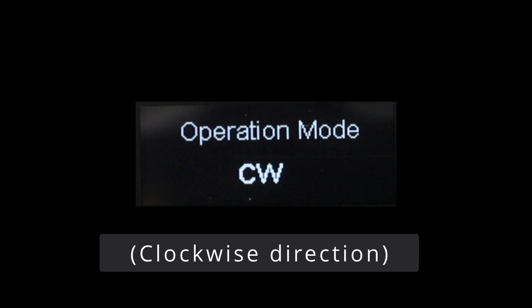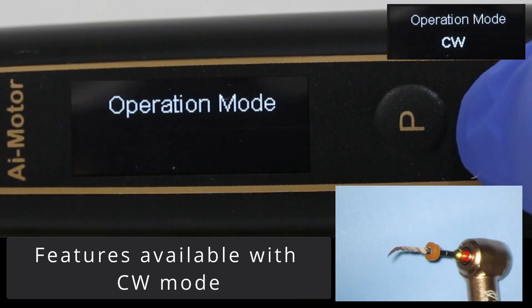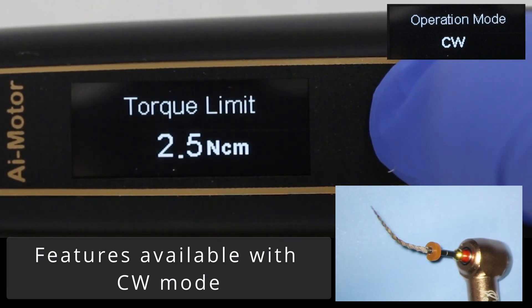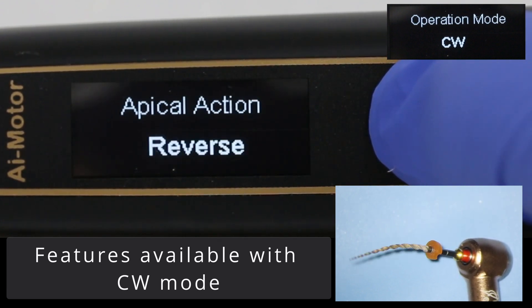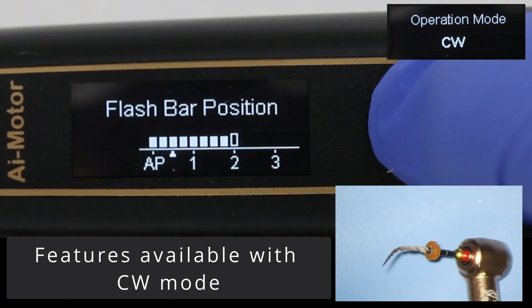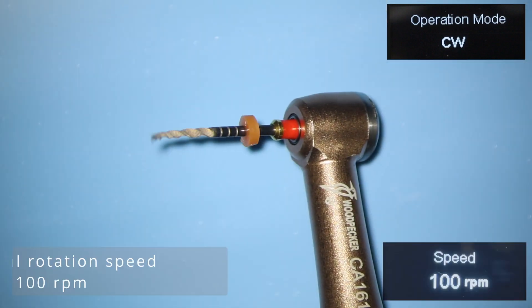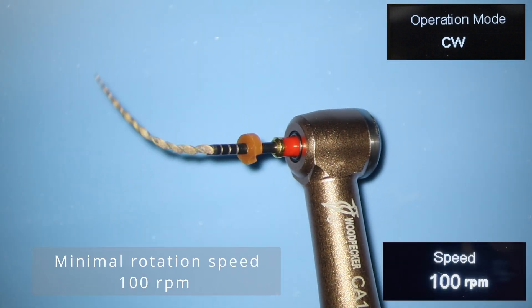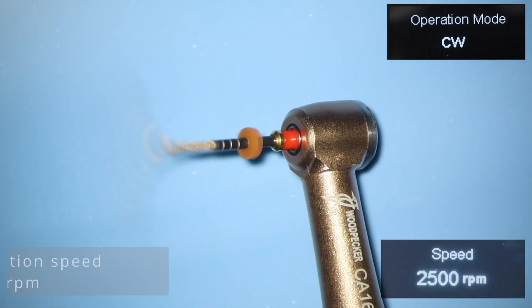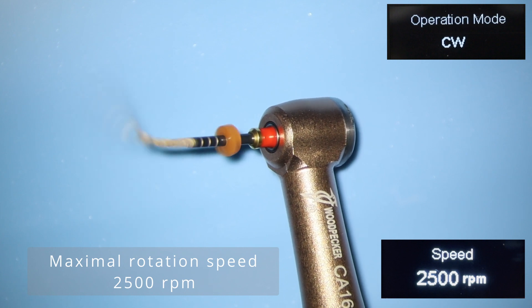The next operational mode is CW, or clockwise rotation. This mode has the most customizable options compared to all the others, and this video will demonstrate the majority of the capability of this handpiece in this mode. You can set the rotation — the minimum is 100 RPM and the maximum is 2500 RPM, which is pretty quick.